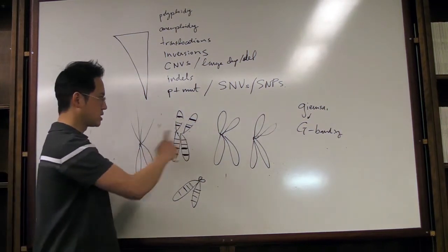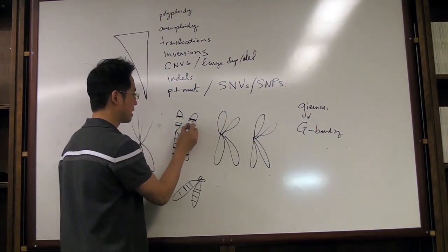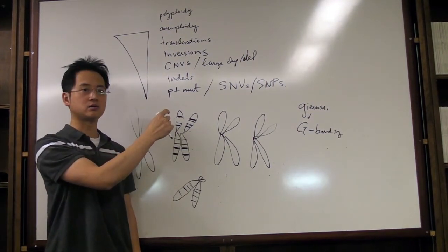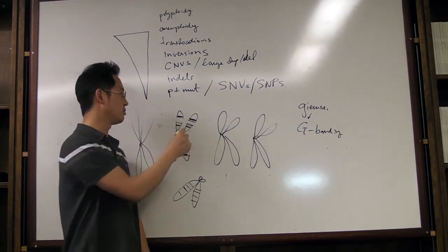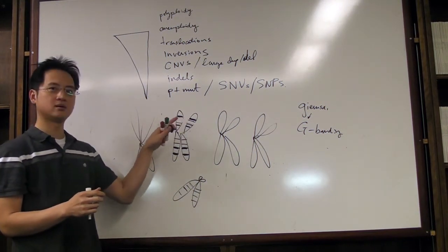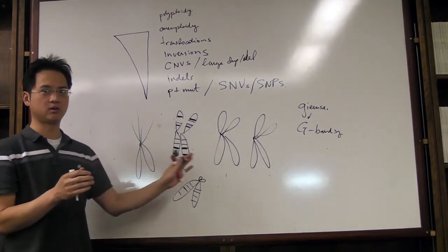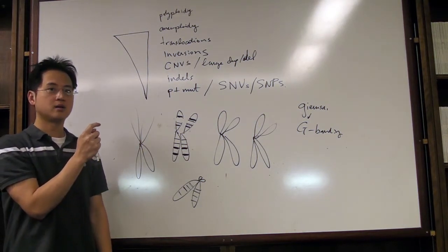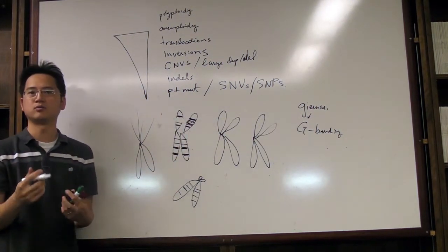So you can basically count the number of chromosomes that you have, and then, like I mentioned before, you can probably detect a subsection of this chromosome being missing here by looking at the karyotype. Just by knowing what the pattern is, with an experienced eye, you can tell exactly what piece is missing. But that exactness is kind of relative. And so if you don't remember anything about karyotyping in terms of process, I want you to remember one number, which is the resolution of this assay. Any guesses as to how small a change I can detect that is, say, deleted or duplicated?